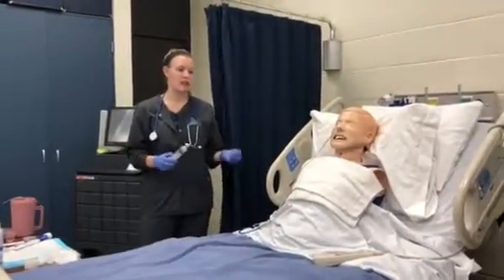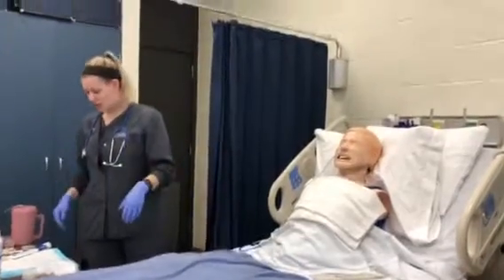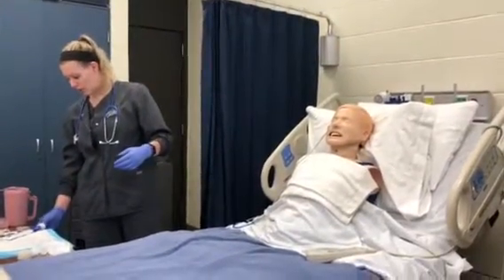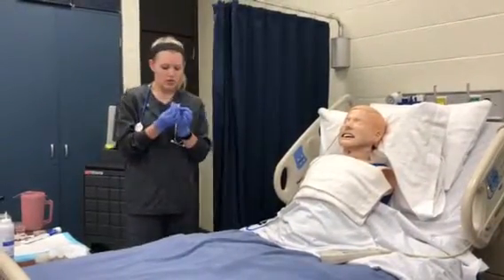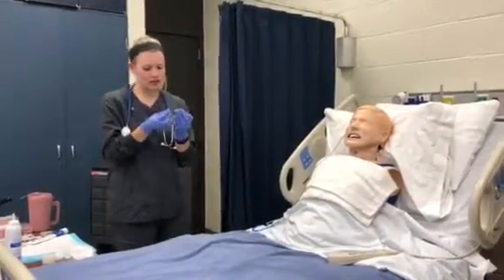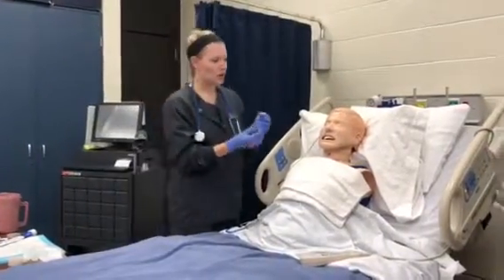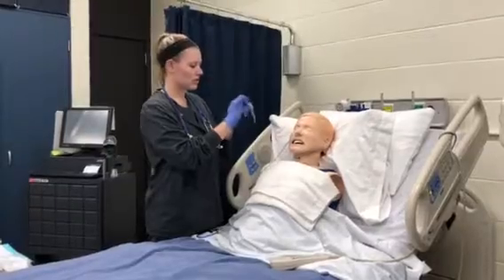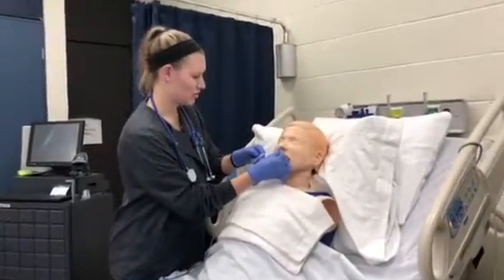So my pH is correct, my x-ray is correct, and I heard the swishing sound. So now we officially know we're in the right spot and that we're able to use our tube. So I'm going to take my little pants tape and secure this, so it's not just temporary anymore.